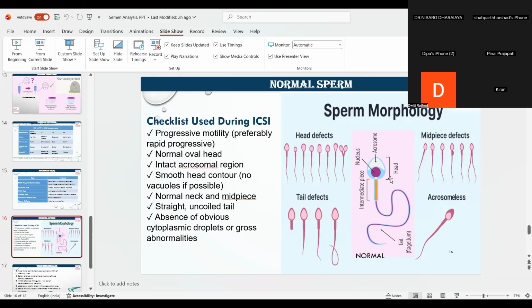We are doctors together here. So there is one question from our side: when you are doing ICSI, is there any role of motility? Do you give any preference to the more motile sperm in comparison to somewhat slowly progressing sperm in your slide?